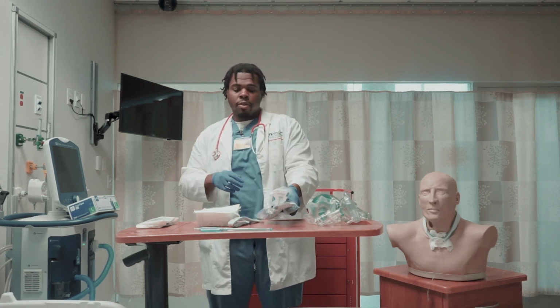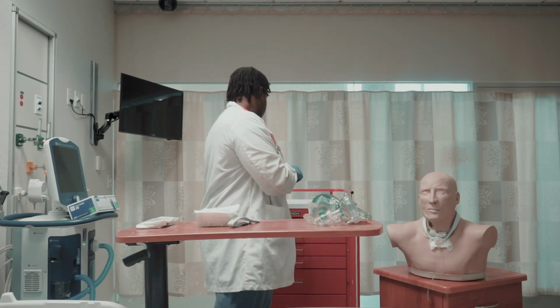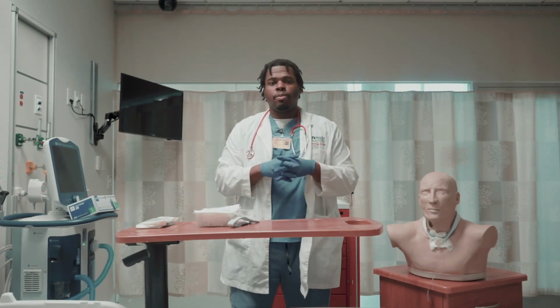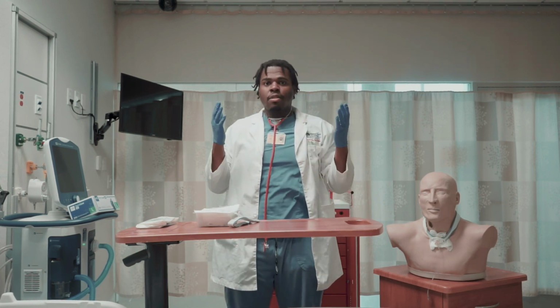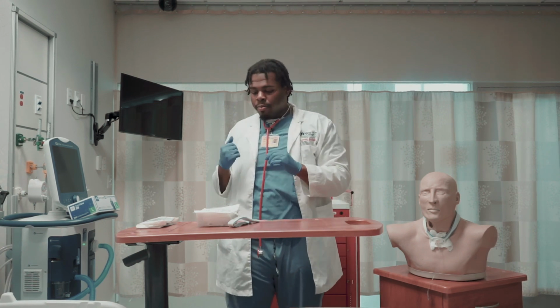I'm going to verbalize the suctioning to clear airways, clear secretions. Get that out of the way for now. Make sure you have this around your neck because we're going to get sterile at some point. You don't want to keep moving back and forth.